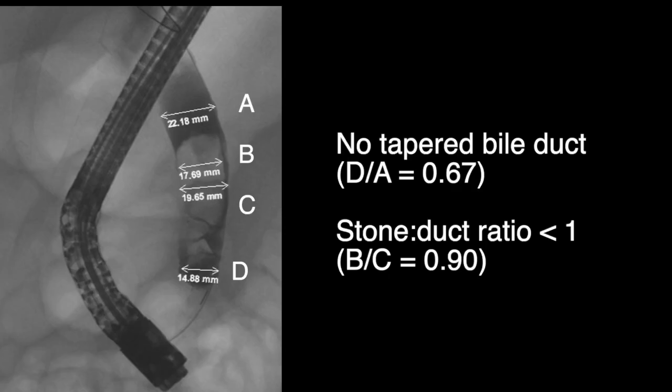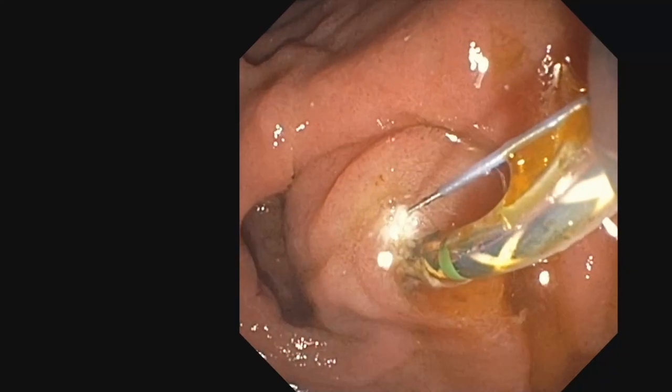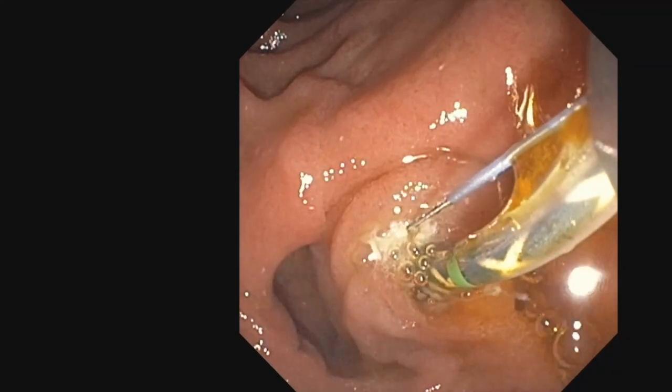In this particular case, the distal duct was not tapered and the stone-duct ratio was less than 1, and hence a determination was made to proceed with ERCP adopting the standard technique. After performing a sphincterotomy to the duct-duodenal junction, stone extraction was commenced.